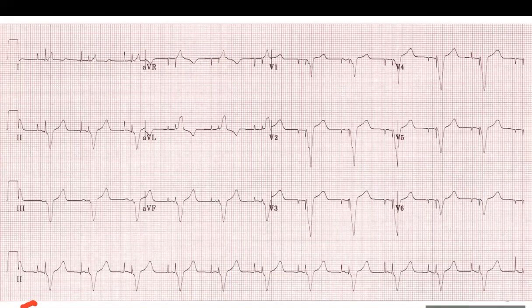Yes, I agree. So there is a dual chamber device. There is both atrial and ventricular sequential pacing and capturing. We can't assess sensing. There is no intrinsic activity, so we can't really see what the device is doing to intrinsic activity. I agree with you.